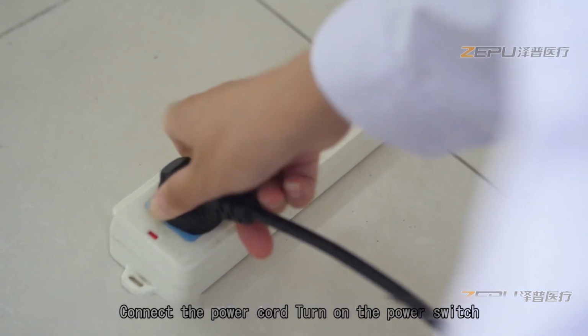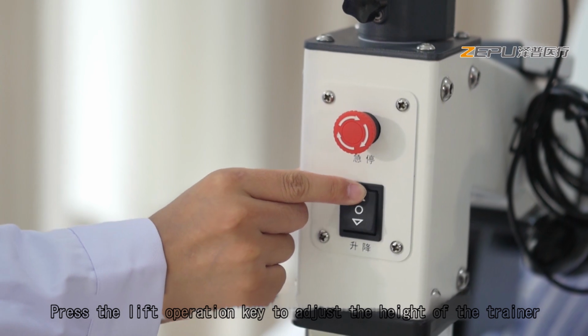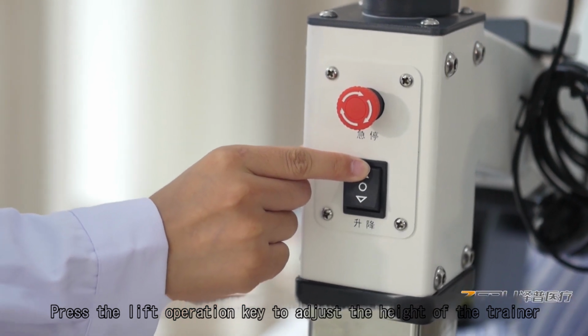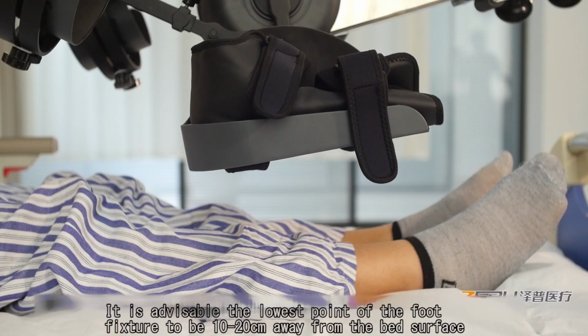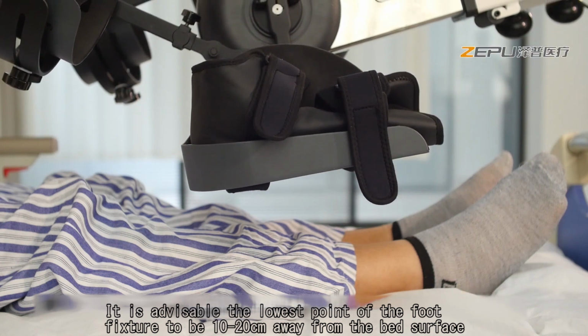Connect the power cord and turn on the power switch. Press the lift operation key to adjust the height of the trainer. It is advisable for the lowest point of the foot fixture to be 10 to 20 centimeters away from the bed surface.